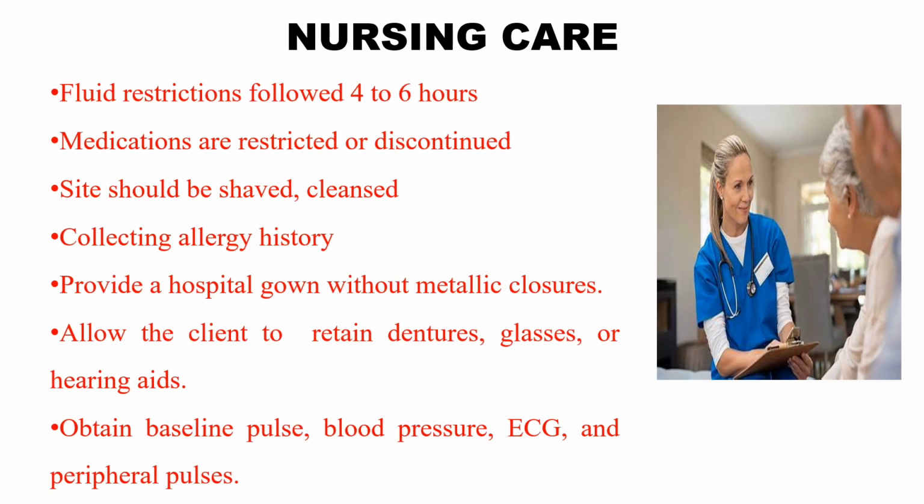Fluid restrictions followed for 4 to 6 hours. Here, ensure that dietary and fluid restrictions have been followed at least 4 to 6 hours before the study. And after that, medications are restricted or discontinued. Ensure that routine medications are restricted, or allowed with permission from the physician, and that anticoagulant medications have been discontinued.